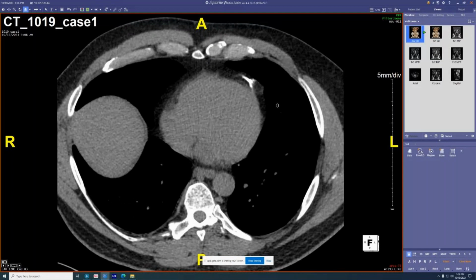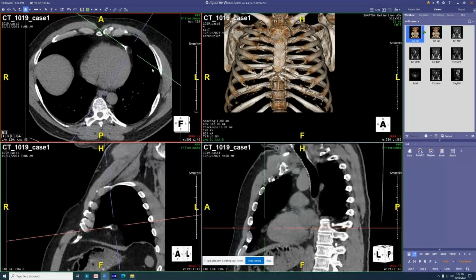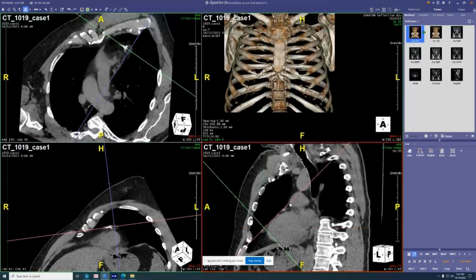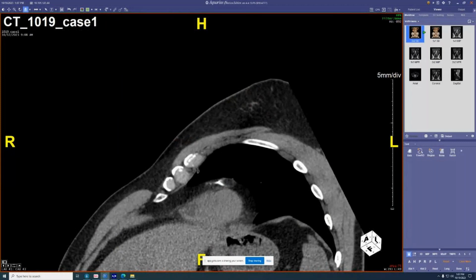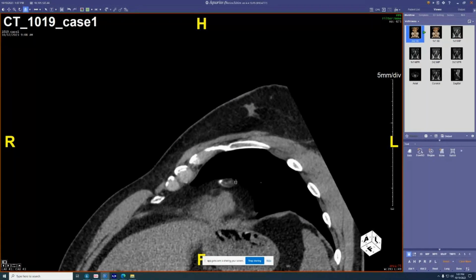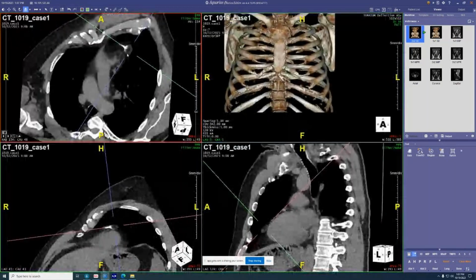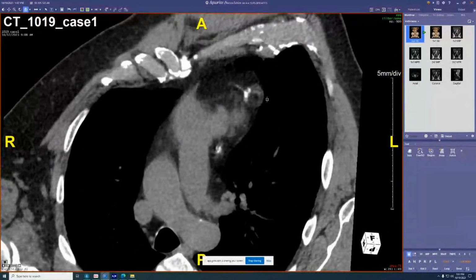Would you guys think of anything else for this? That was my exact thought. Yeah, I think it's in the right place, and I think your calcification is probably the little pedicle of whatever that thrombosed and torsed. Exactly, exactly. And beautiful, that's what you can see, that calcium goes right into this little vessel that goes through it. So that's what I assumed it was, and I called it just healed epipericardial fat pad necrosis with a torsed pedicle of the vessel.